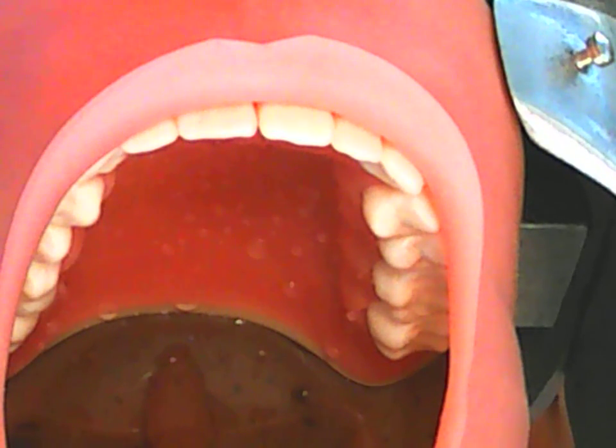You must receive client consent before applying, so make sure they agree and tell you that it's okay to proceed. Once you receive consent, maintain your principles of ergonomics by positioning yourself, your client, and the equipment properly to facilitate application and removal. Remember to practice proper instrumentation using a fulcrum throughout your appointment, and your mirror for indirect vision and retraction where applicable.